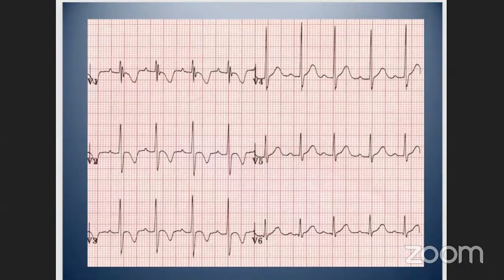Hi, Dr. Murphy. Yes, I guess some information that you might want to know as well on this ECG is with regards to the axis. So possibly, do they have a right axis deviation on the ECG? But most likely, these features are in keeping with the right bundle branch block. So the RSR pattern with a bit of QRS widening. The inverted T waves that are found in V1, 2, and 3 indicate that there's some sort of right-sided strain happening on that side of the heart as well.